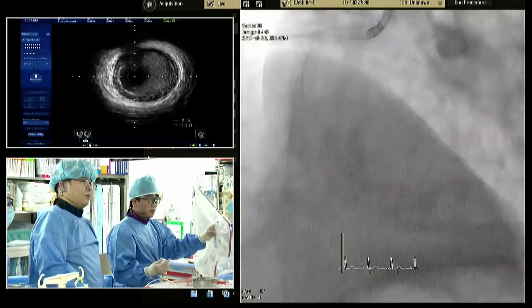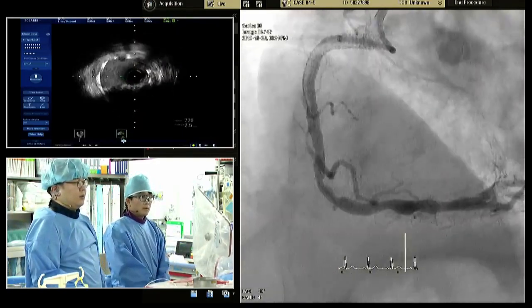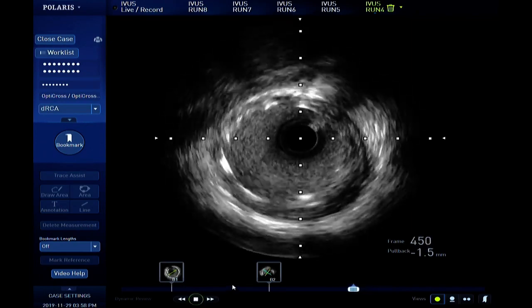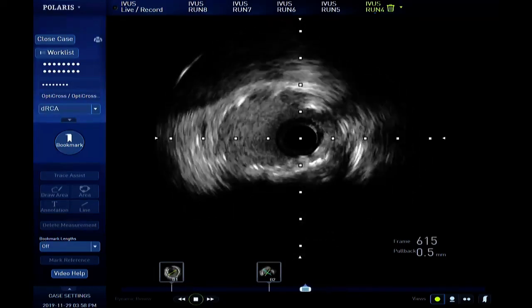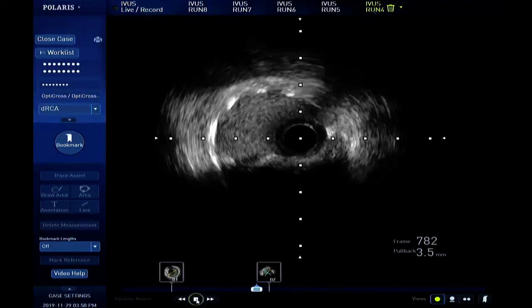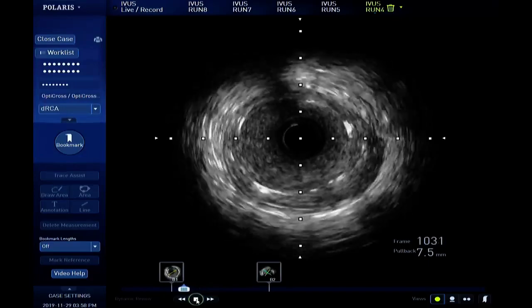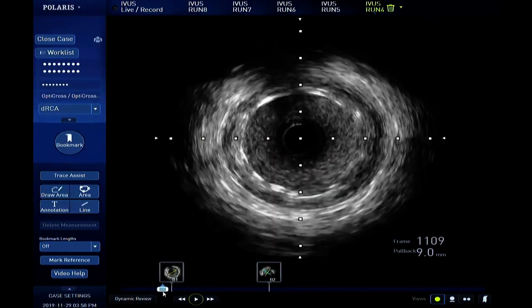And please let me show you the post-stent IVUS. I got the 3.75 at 22 atmospheres. So the distal landing is okay. This is the distal RCA. And as expected, the stent is a little bit elliptical. Stent area is good. And actually, we measured the stent area. It's about 7 millimeters square, which is not that bad. Good. And the proximal is okay.